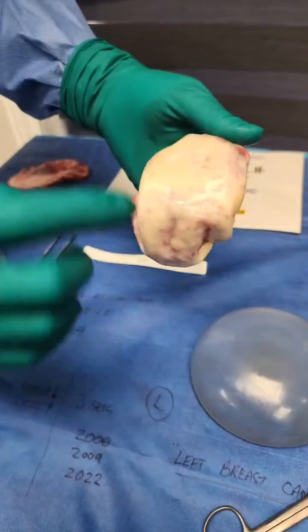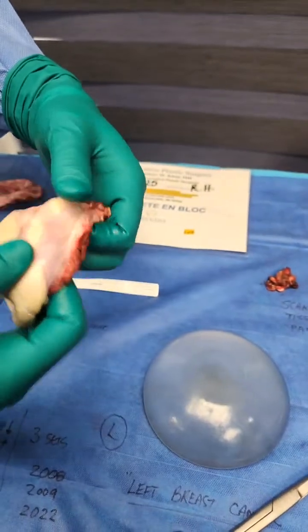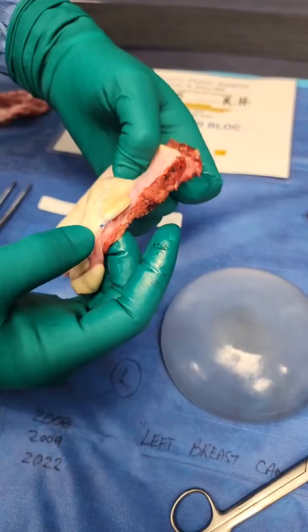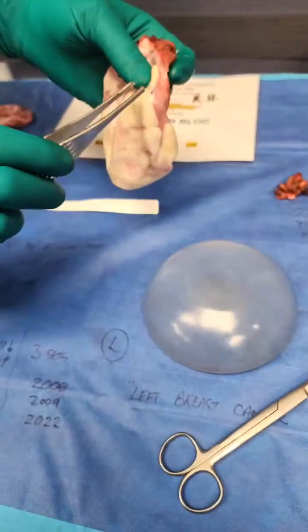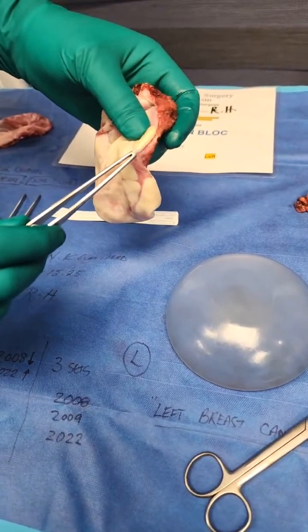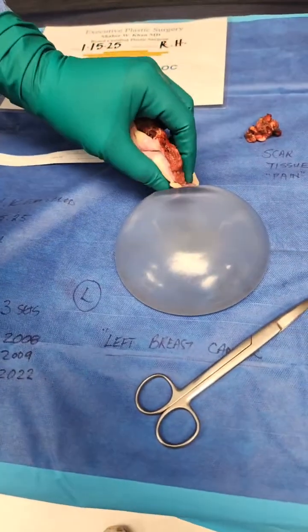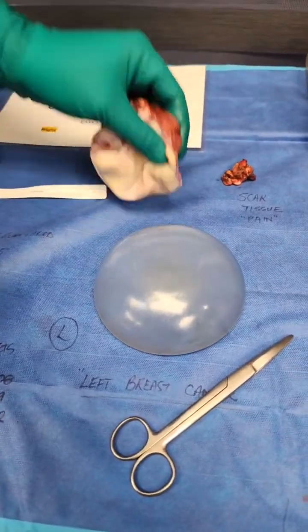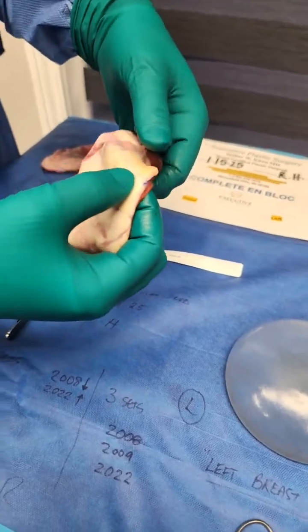So this is alloderm. Very good amounts of it, lots of it. And you can see on the inside, look how they sutured. Look, you have a knot right here, and you can imagine, look, this knot. I don't like to see this, especially when it's going to be rubbing against this sensitive implant. And as you can see, this alloderm was sutured together to itself.